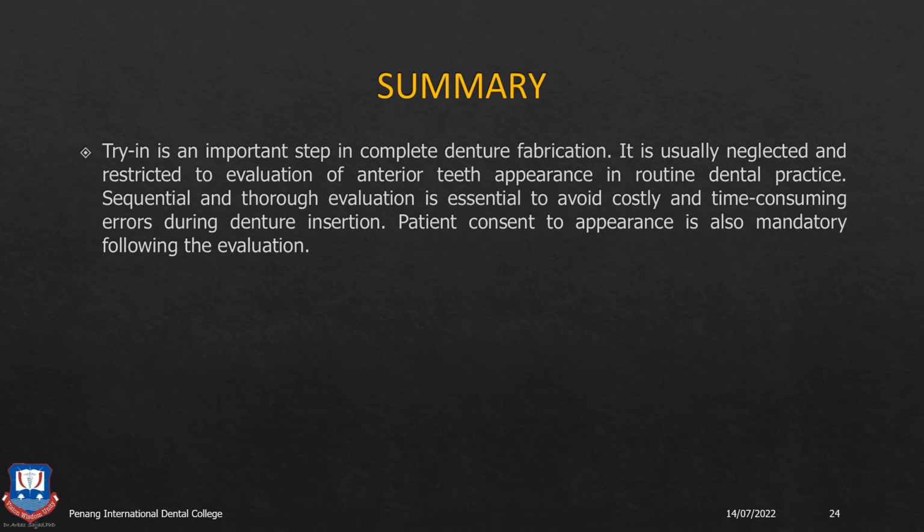But later, after the denture insertion, at the review appointment, you get to hear different things, like the patient is unable to chew soft food, or unable to chew rice, or when the patient chews on one side, the denture lifts from the other side, or the patient has gagging, or loss of retention due to the poor postdam or poor retention, or the patient complains of pain in the peripheries of the denture because of overextended flanges, or obliteration of the relieving and limiting structures.